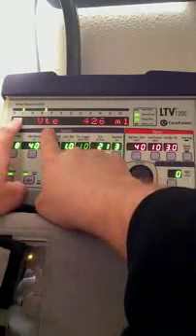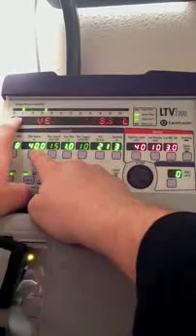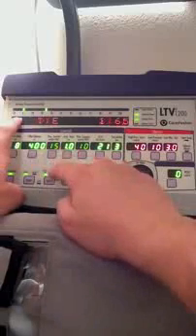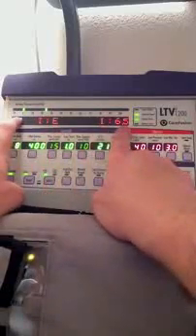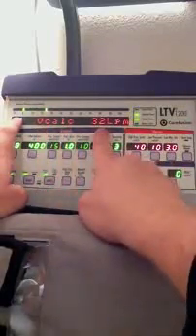This is my VTE, or my exhaled tidal volume. It's 423. I have it set at 400, so I have just a little more going out than is going in. This is VE, that's minute ventilation, 3.3 liters per minute. Of course, minute ventilation is just the respiratory rate times the tidal volume. This is my I:E ratio, it's 1 to 6.5. This is VCalc, or my calculated flow, 32 liters per minute.